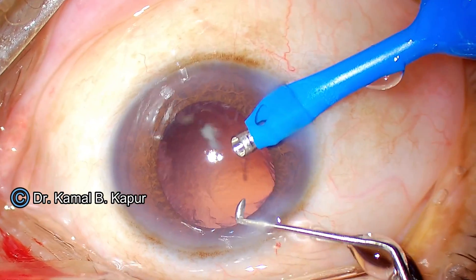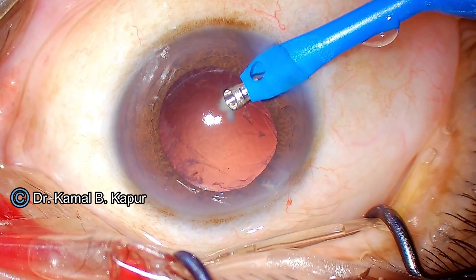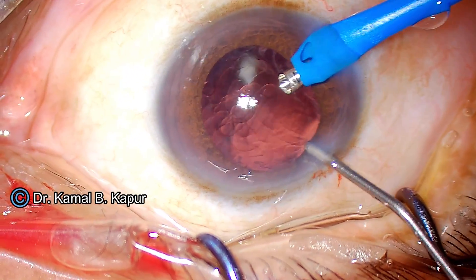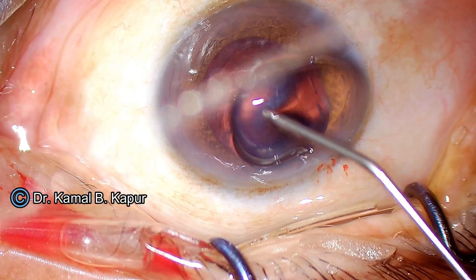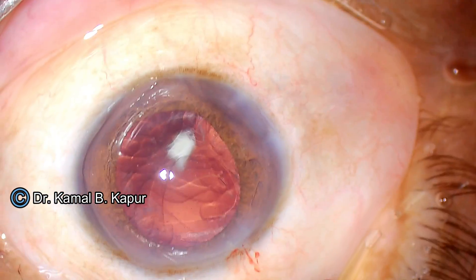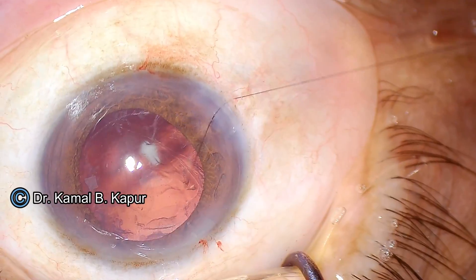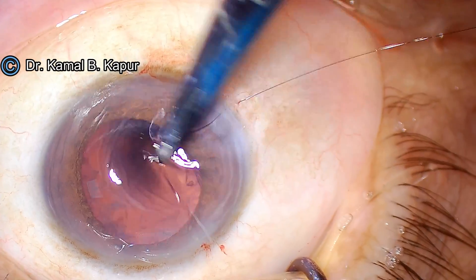Before withdrawing the irrigating instrument, I instill a slight amount of viscoelastic, making sure I do not overfill the anterior chamber — overpressurizing it will cause viscoelastic to go into the vitreous and cause vitreous loss. The second step is to close the wound, because I will now plan to do an anterior vitrectomy.